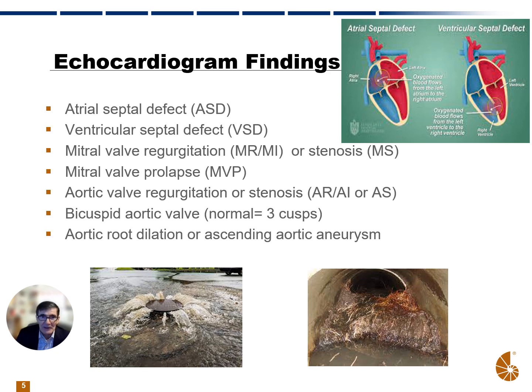Also, an echocardiogram is used to assess mitral valve prolapse. So the mitral valve is going in the wrong direction when the ventricle is contracting.